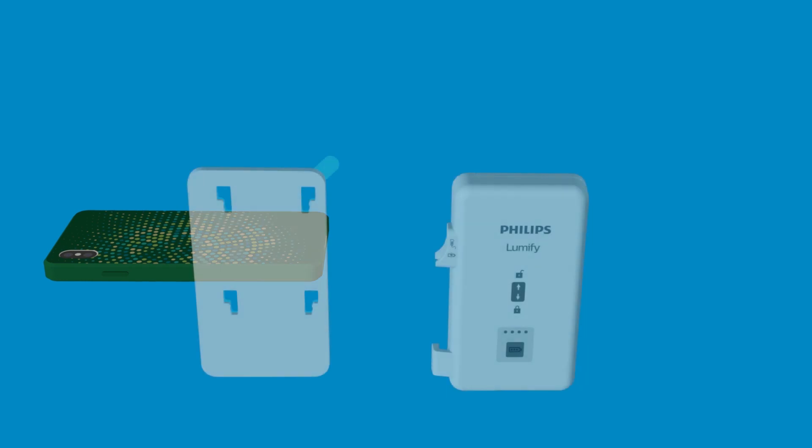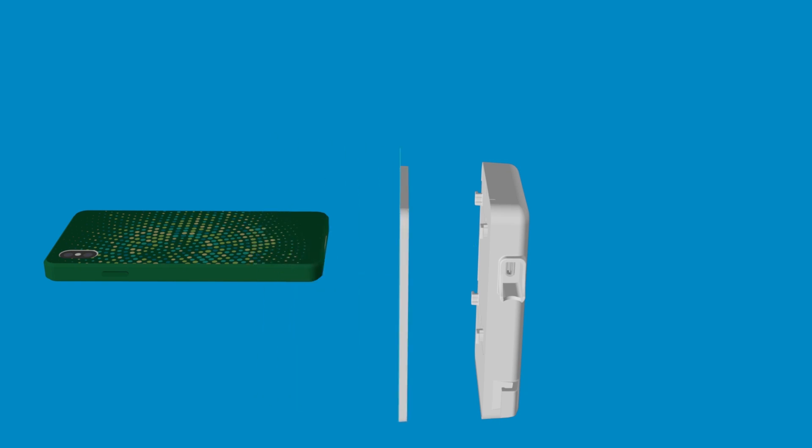Now, attach your mounting plate to your Lumify power module by lining it up with the mounting holes and ensuring that the blue side of the plate is facing away from the module.